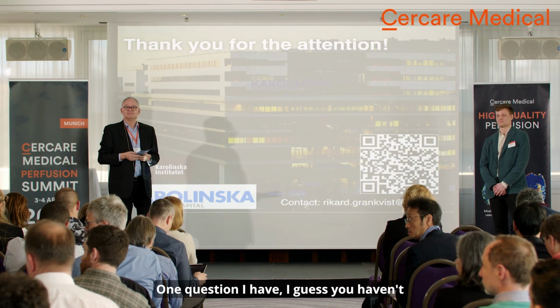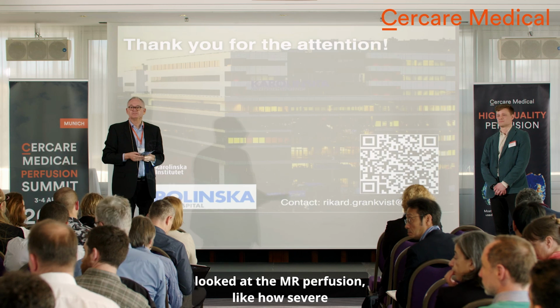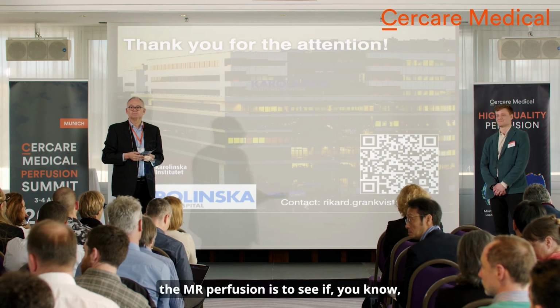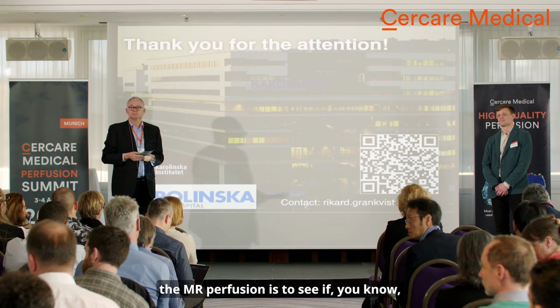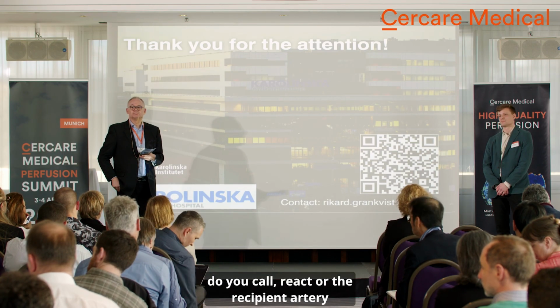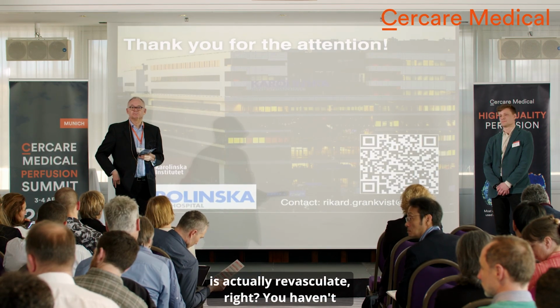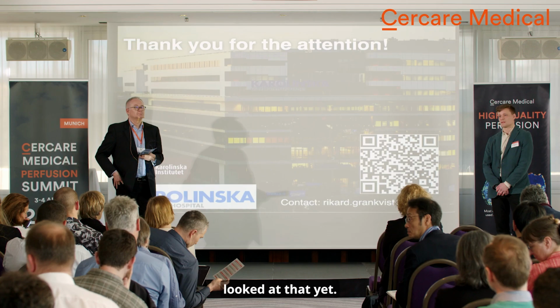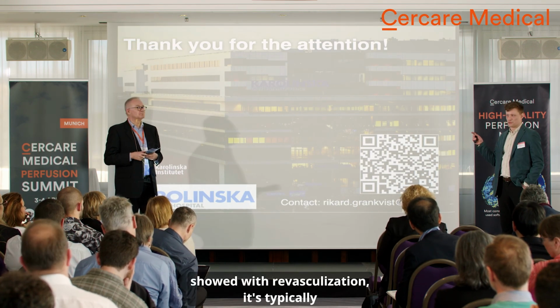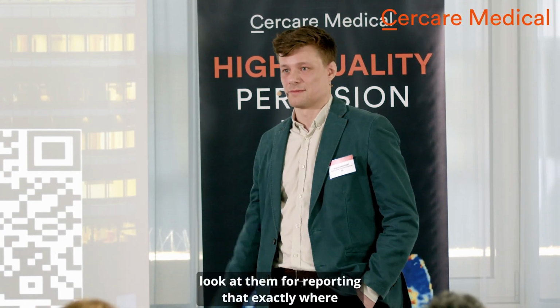One question I have: I guess you haven't looked at the MR perfusion, to see how the patient reacts when they go to surgery, or whether the recipient artery is actually revascularized. Not systematically, but in one of the cases I showed with revascularization, it's typically very apparent when we look at them for reporting.